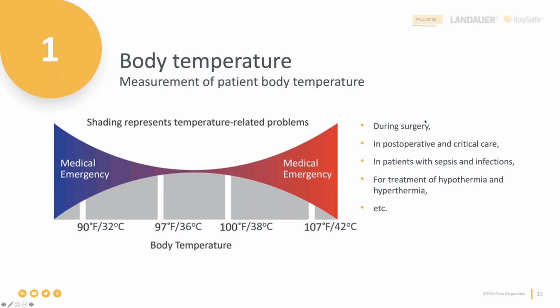It depends where it's being used too. If you're using it to allow entry into a building, you might have a different acceptable range than if you're diagnosing a patient. And again, there are different technologies that have better accuracy in terms of the application. If you think about dermal, oral, all of those different ways, some are better than others, and some are more prone to outside temperature or whatever might be happening. So it does depend on the application as well.